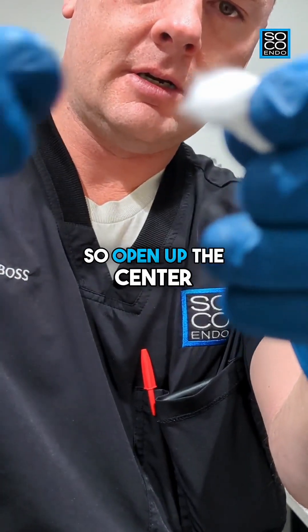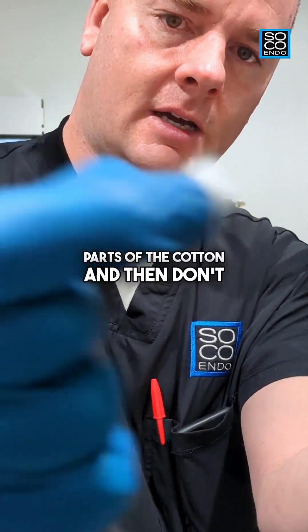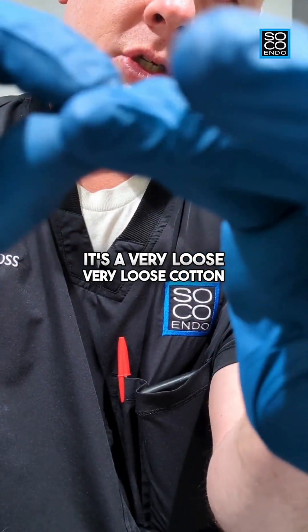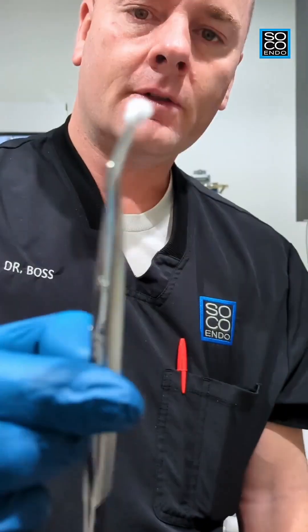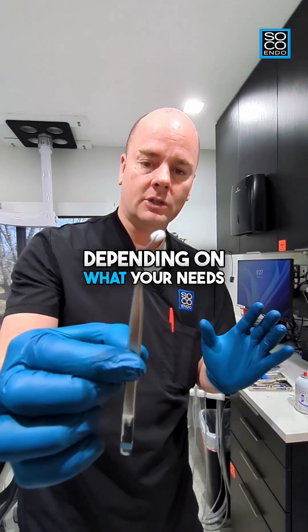Open up the center and get those loose, wispy parts of the cotton. Don't make a string out of it. Instead, bunch it together so it's a very loose cotton pellet. Then pinch it with your cotton pliers and you have a very nice custom-made pellet. You can make it bigger or smaller depending on what your needs are.